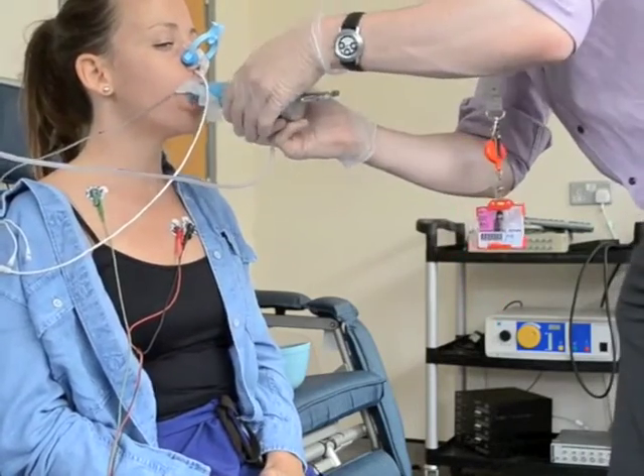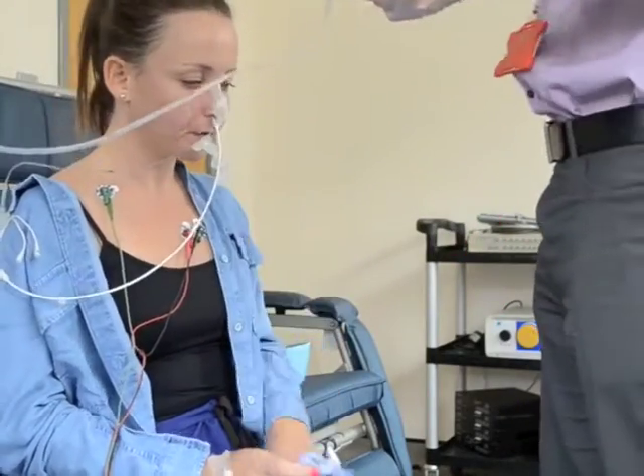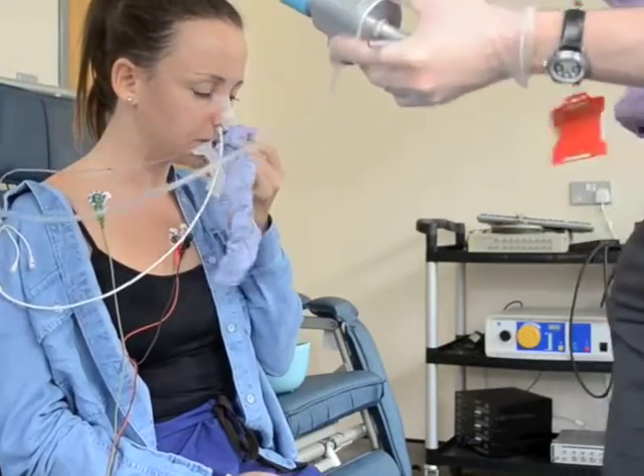The valve that Monique is putting in her mouth and then sucking on measures the overall breathing muscle strength and the pressure in the mouth.